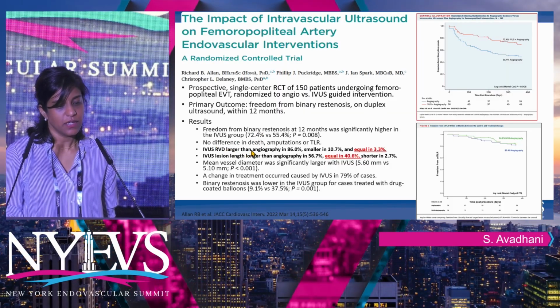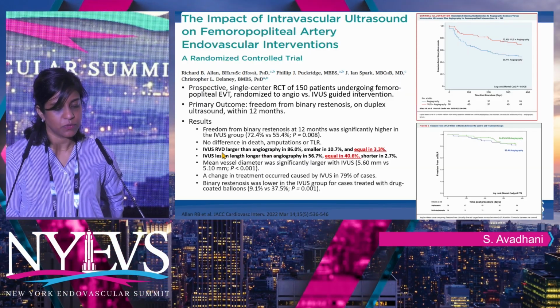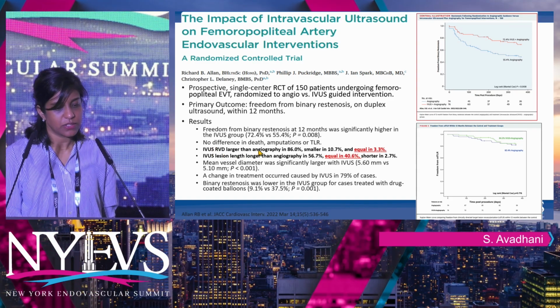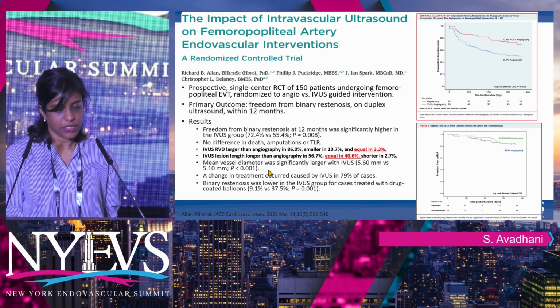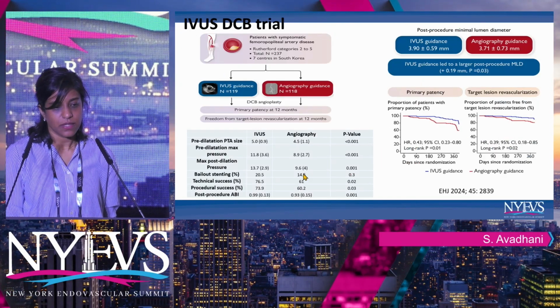was no difference in clinical outcomes like death or amputations or TLR, but IVUS was associated with larger reference vessel diameters and longer lesions as well compared to the angiography alone arm.